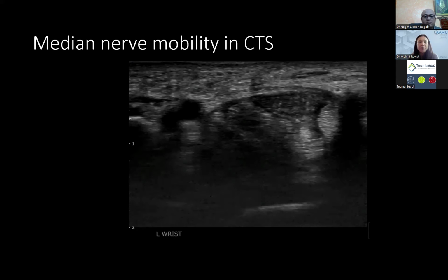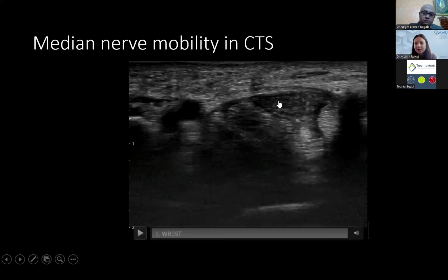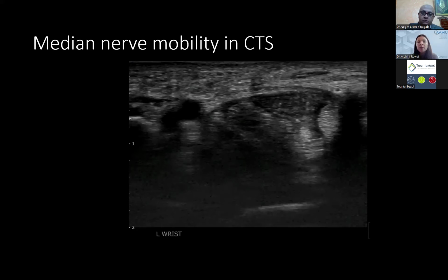If you have a machine which has a scale from red to blue, blue means there's harder tissue in strain elastography. This is going to show a stiffer appearance. If the contralateral side is normal, you can compare, and you will see a different stiffness scale there. A nerve will be more pliable, not stiff, compared to the symptomatic side. So I see there is value in adding elastography if you have that available. The limitation at this point is that it does not have very good norms, so it's not as quantitative as cross-sectional area, but it can definitely be added if you have that feature available.